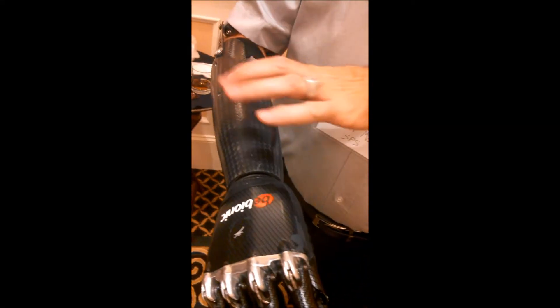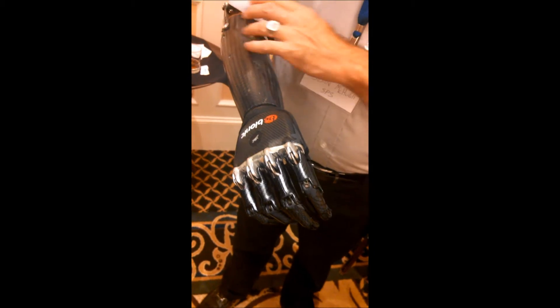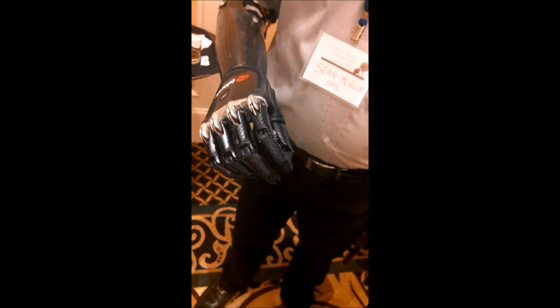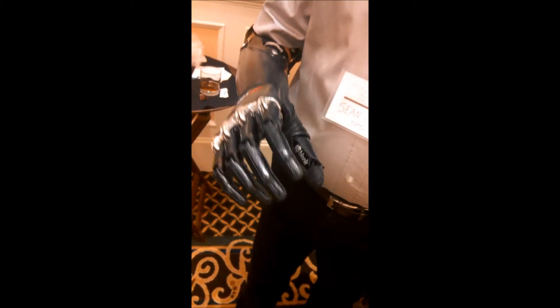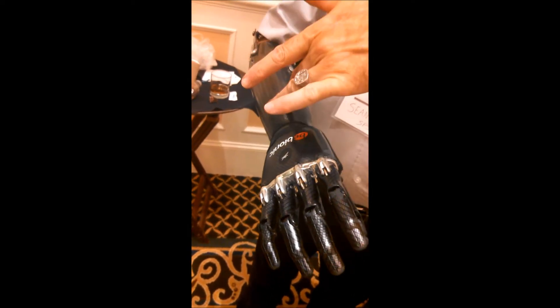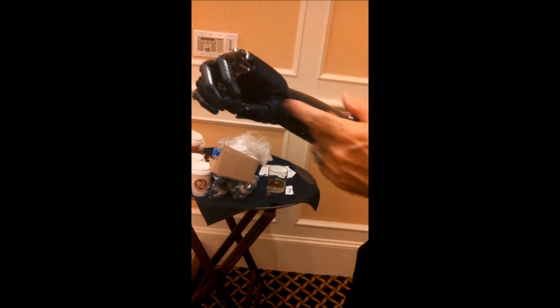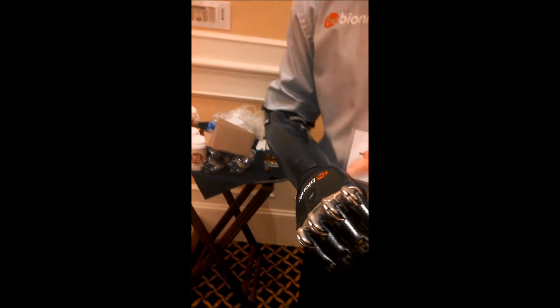There are two electrodes that sit on the surface of my skin that read my muscle intentions. When I feel like I'm opening my hand naturally, it's this muscle belly on this side that's firing. The electrode is sending that signal to the hand. When I close my hand, the electrode on this side is the one that's detecting that and making it happen.